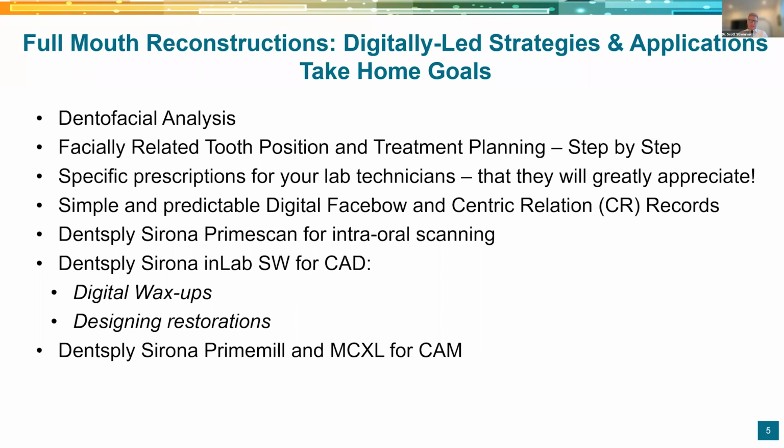This is an area that, if you're doing cases like this, you're going to have to set the case up correctly with your face bow, and then how are you going to manage your vertical, whether it's with a CR record or myofunctional. That doesn't matter per se in this presentation, but you have to have a way to do it. I happen to be using the centric relation record. John Coyce has helped me with that.